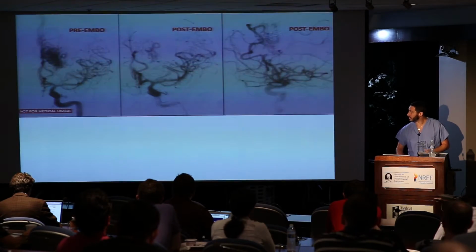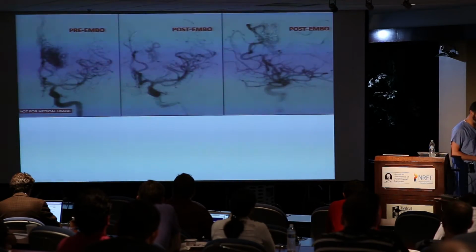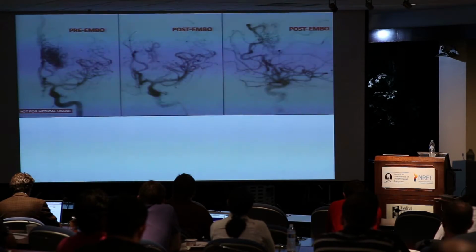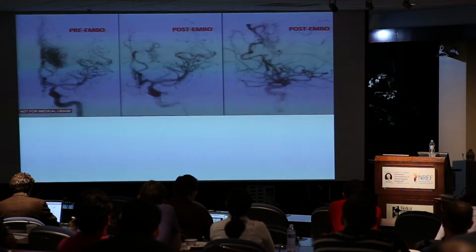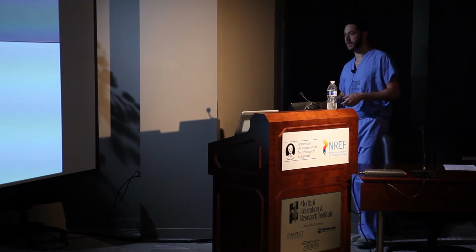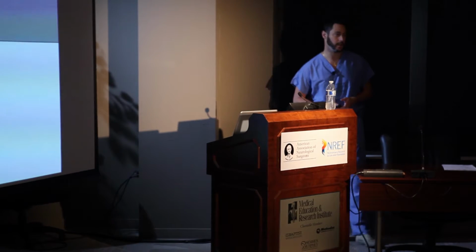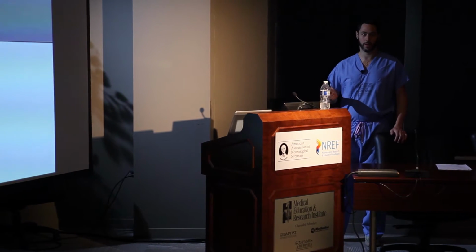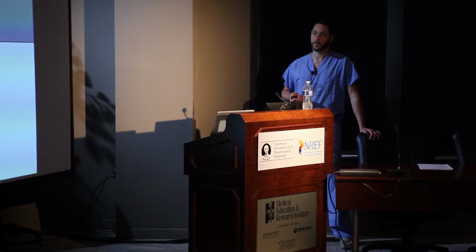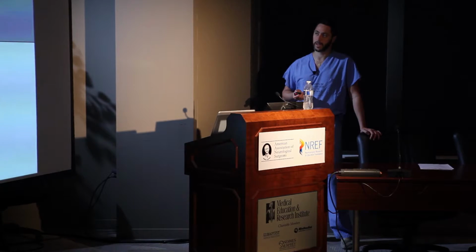So this is also incredibly important. What do you do at the end of an embolization? You take a whole head run, right? You look at what you just accomplished or didn't accomplish. I remember this, I'll never forget this, going into the control room, sitting down and looking at this. And I don't know why we developed an audience that day, but there was a lot of people in the control room, and everyone was real happy because they were looking at the nidus.